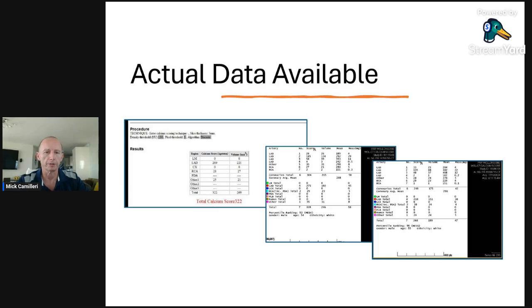As you'll see, it's broken down as a first pass in the different arteries, and then even within the further detail, each lesion. So if you've got 6 lesions in the LAD, you would see 6 lines here. I've got 4 in this case here, 1, 2, 3, 4, a bit in the other, and 2 in the RCA. And they give you data by the score, the volume.